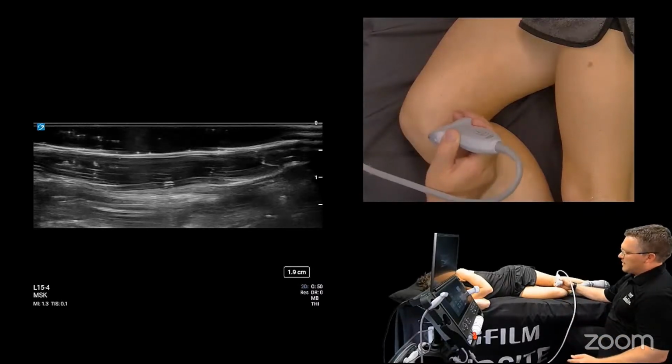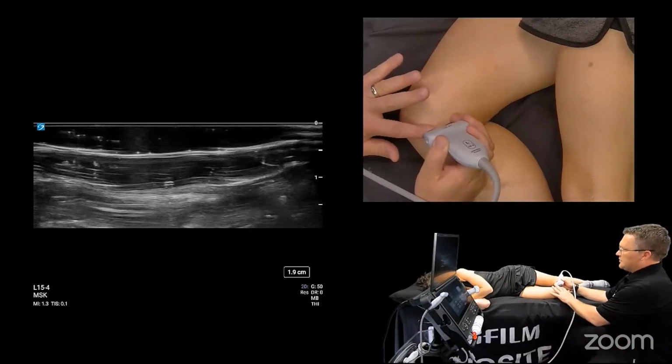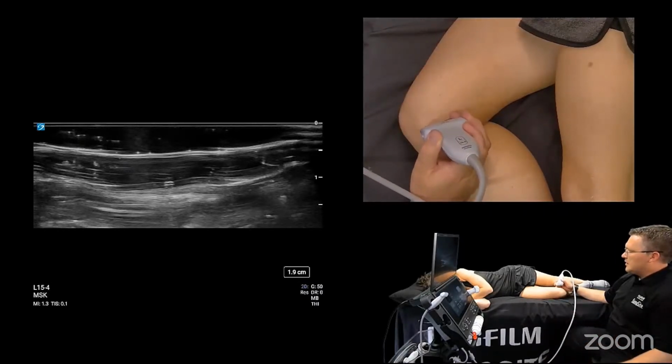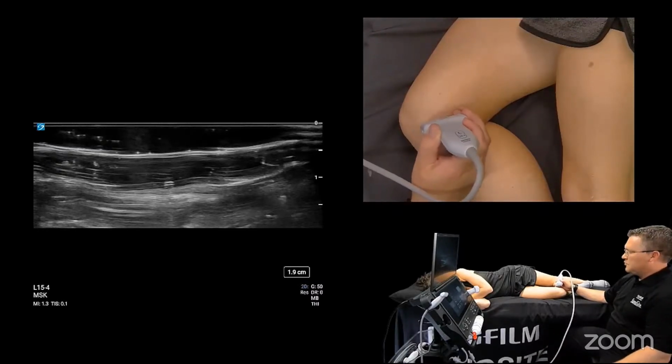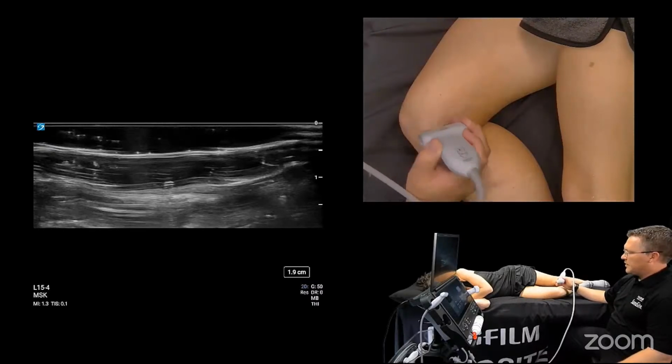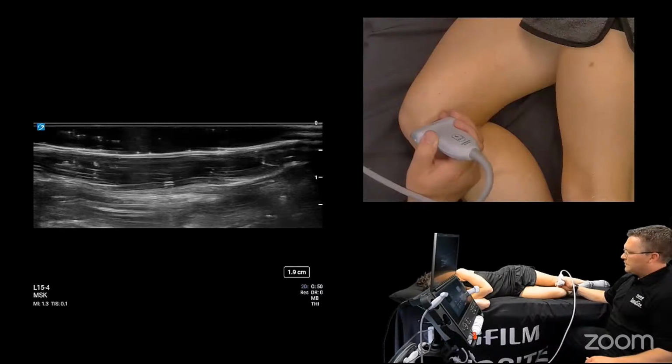So I'm doing that back here with my fingers. There's a little scanning pearl. Because we're dealing with superficial structures, I don't want to collapse any degenerative conditions that may show up nicely on ultrasound. I don't want to collapse any bursitis or any joint effusions that may help me. So you don't want to start off just by cramming the tissue because we're trying to palpate while we scan. But what I will do is feel ahead of time.